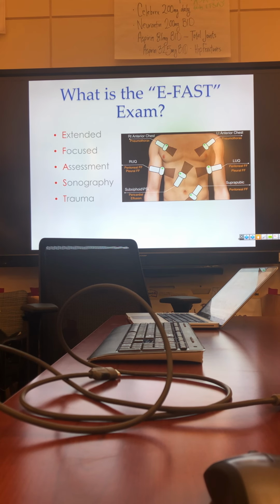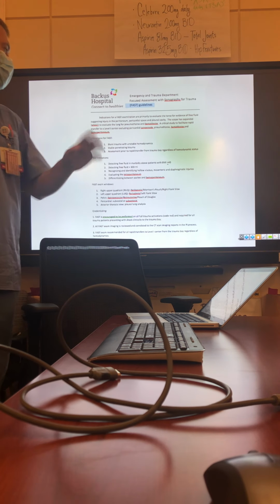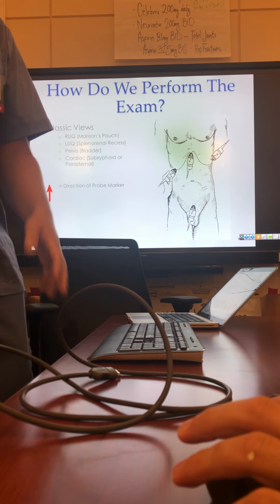As far as pneumothorax, we're really looking for a clinically significant pneumothorax on the lung ultrasound. We're also making an assumption that this patient is lying flat. So this is your flat trauma patient. Air rises, so you're only looking at two spots here. You're just looking at about the second or third intercostal space on each side, just one view. And the truth is, if you have it, you're going to put a chest tube in anyway.